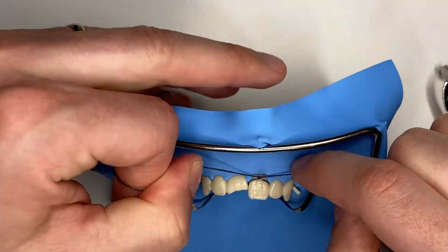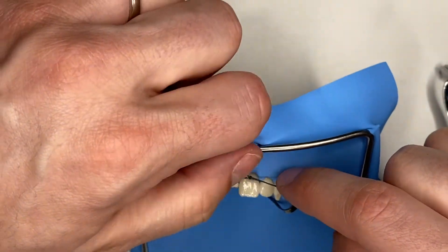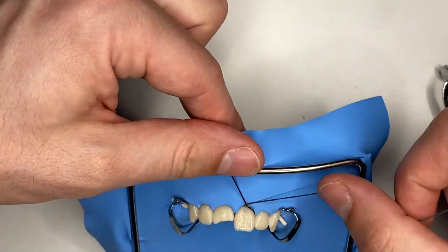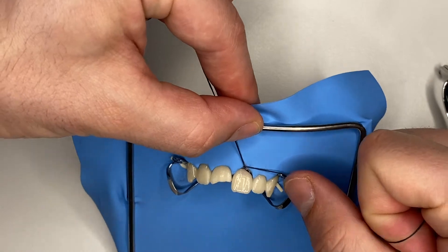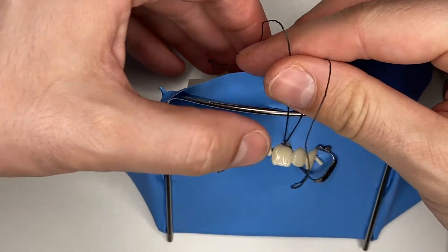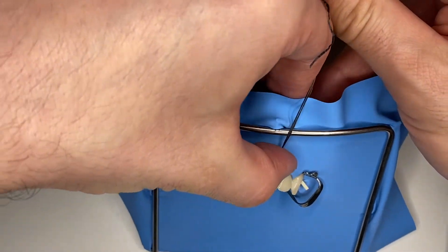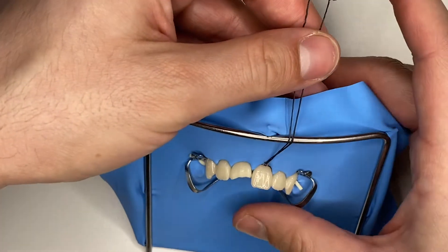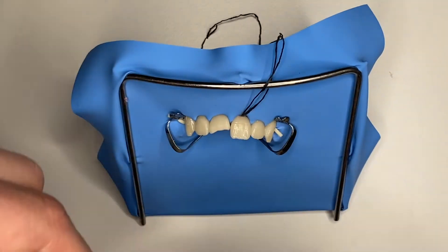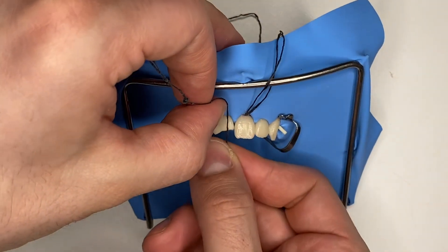Of course it helps if your assistant is going to use a probe and fix this to the palatal side, but if you don't have an assistant, you can always gently insert it, then tighten it some more and make sure it goes wherever you want it to go. That's number one done. Now we're going to do the same for tooth number 1.1.